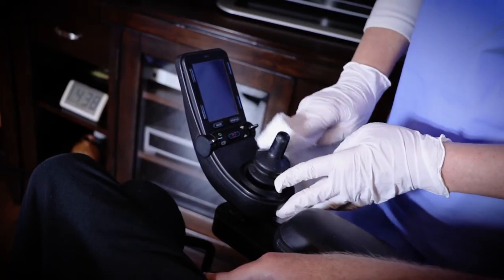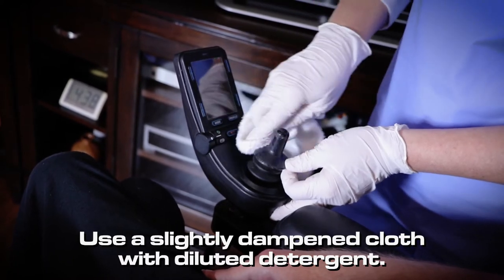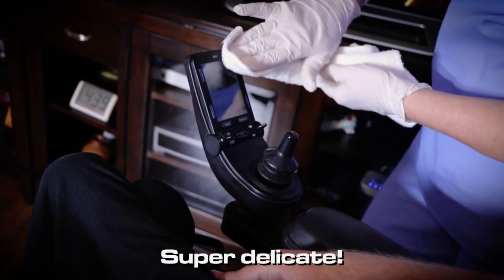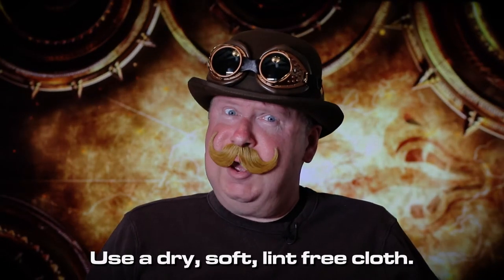Now to a very sensitive spot — no, not there — your joystick. For this, you only want to use a cloth that's been slightly dampened with diluted detergent. Use this for the housing and the boot. I'm not sure what the boot is, but that's what the script says. The LED screen is super delicate — no window cleaners, scouring powders, cleaners with solvents like alcohol, benzene, ammonia, or paint thinner. No abrasive pads, not even paper towels. This is one delicate flower, and you only want to use a dry lint-free cloth.